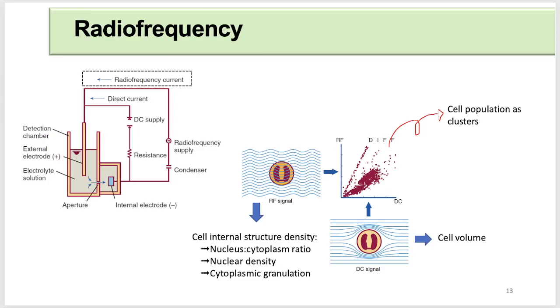Now, we're done with your electrical impedance. Now, this is another concept that I want you to understand: your radio frequency. May mga machines na hindi lang gumagamit ng electrical impedance, but also it uses your radio frequency. Kumbaga, it's a combination of different principles. So, may impedance na, hahaluan mo pa ng radio frequency.